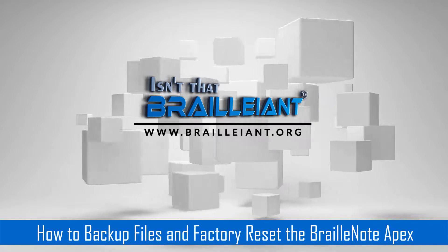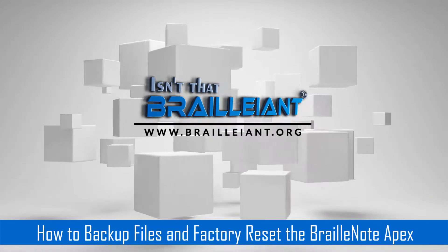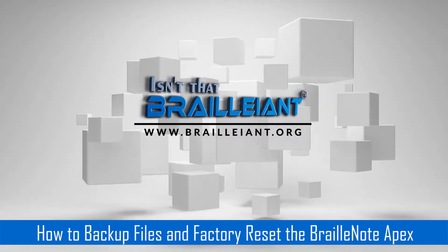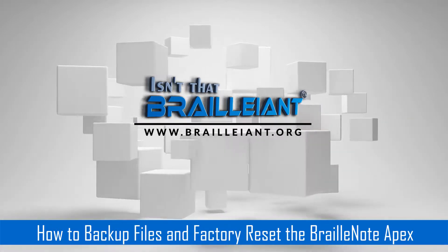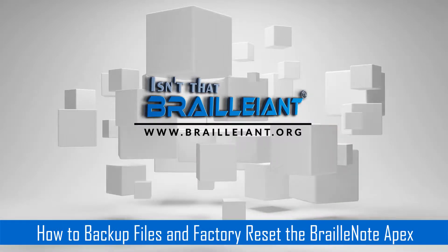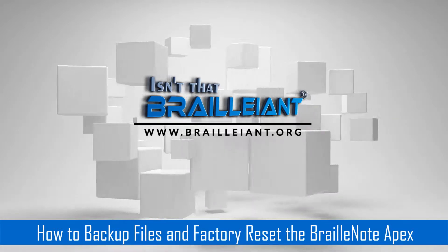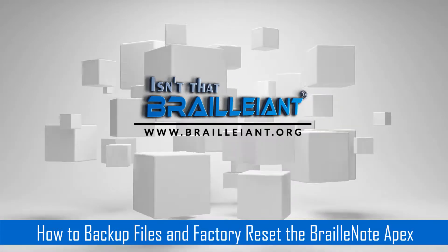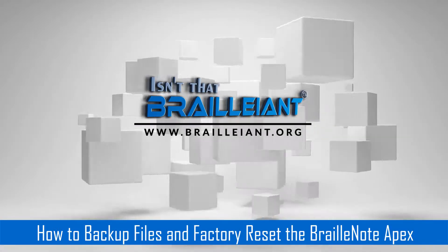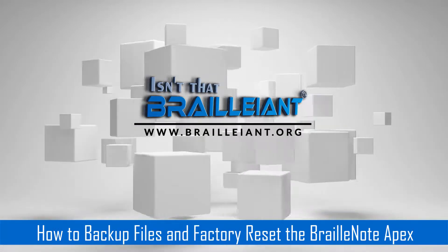This is going to be my last day of recording for the BrailleNote Apex, as I am getting the BrailleNote Touch tomorrow. I'm going to cover backing up your files as well as how to perform a factory reset. These are the procedures you need to go through when you are giving your Apex away to somebody else, donating an Apex, or perhaps getting a new BrailleNote.